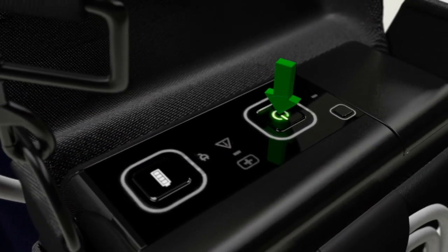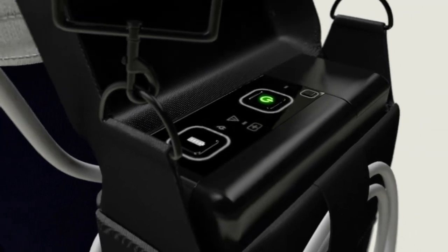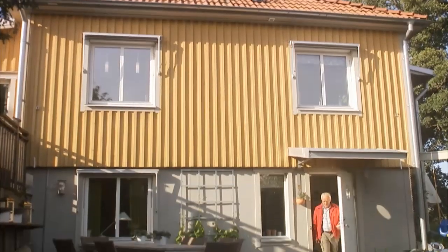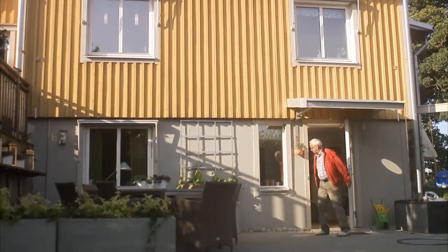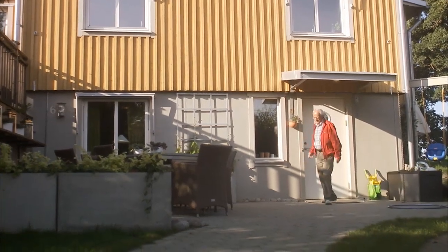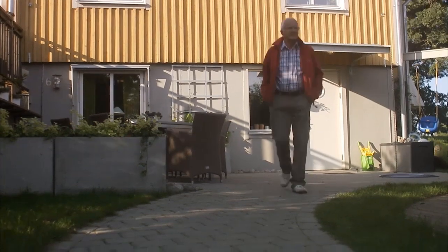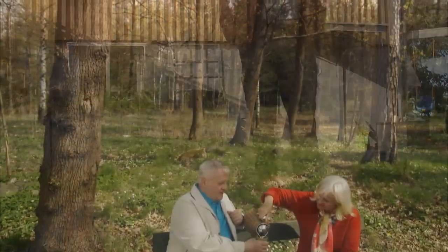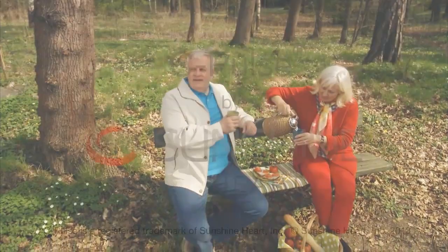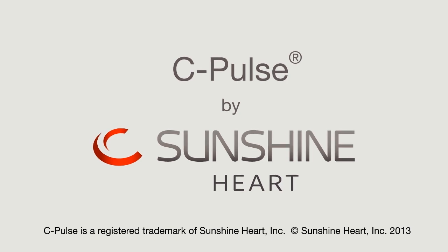The device will automatically re-synchronize to the patient's heartbeat and resume therapy. With the increase in coronary blood flow and a decrease in myocardial work, the patient's heart may be provided with the opportunity to recover. The Sunshine Heart C-Pulse System is CE-marked and available for use in Europe and those countries that recognize the CE-mark. In the U.S., C-Pulse is an investigational device and is currently enrolling in a pivotal trial. C-Pulse, for the management of moderate to severe heart failure.